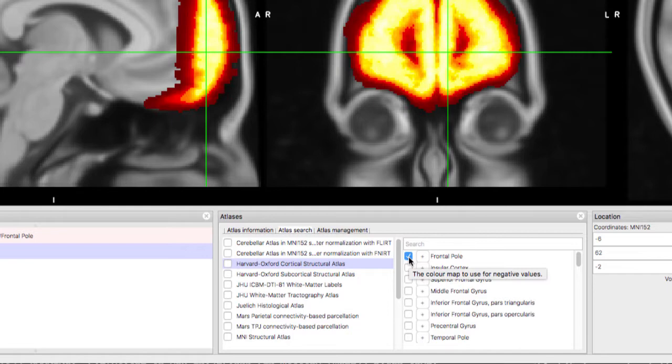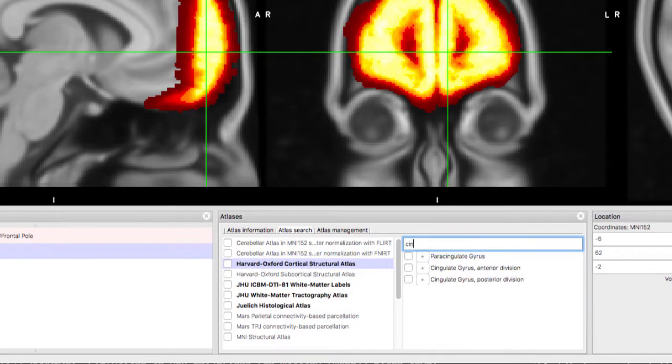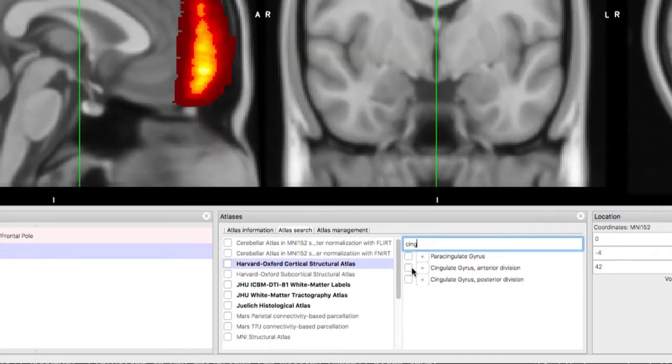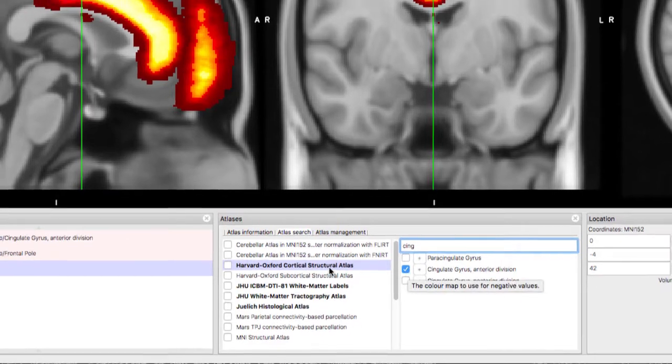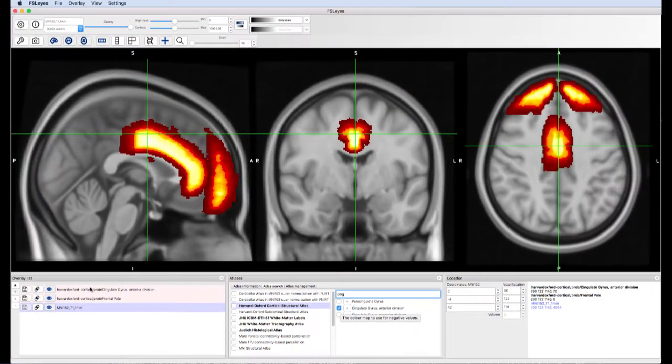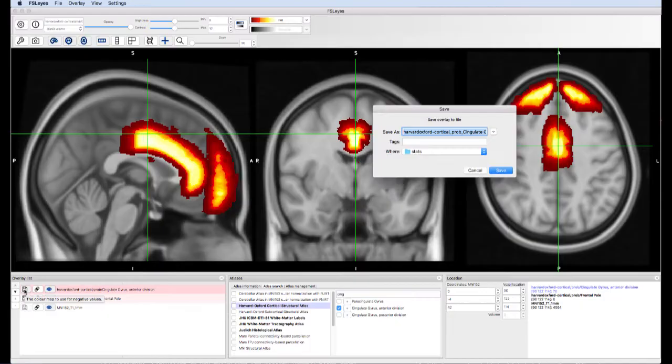You can refine your search by typing the name of the structure you're looking for. The atlases containing the string you typed will be highlighted. You can save the structure into a separate nifty file by clicking on the disk icon next to the structure. These can then be used for ROI analyses.